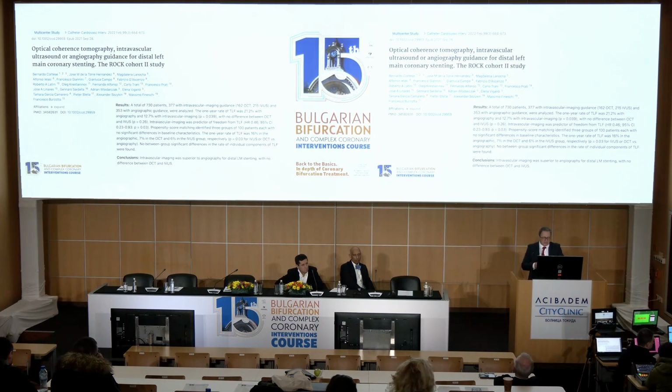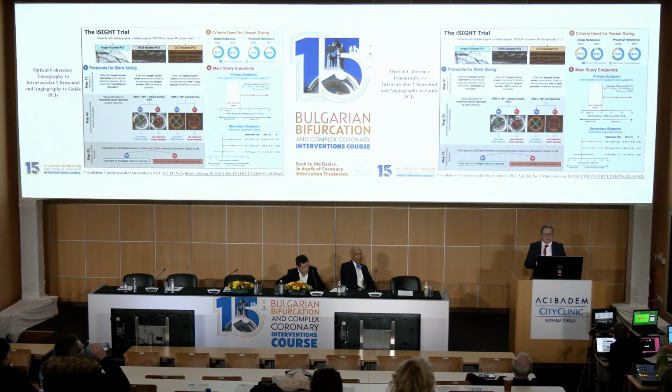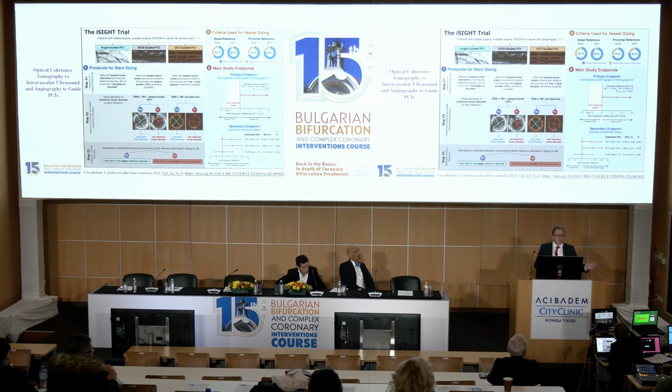Let's say that the authors concluded that intravascular imaging was superior to angiography for distal left main, with no difference between OCT and IVUS. So what we need right now are the numbers. We have to create this cutoff criteria as is already done for IVUS. Here you see another trial showing that OCT is not in a very bad position.